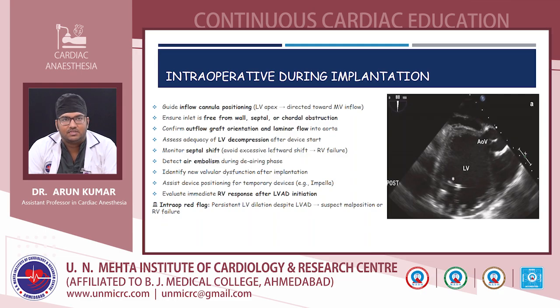And also we should monitor the septal shift, and there should not be any excessive leftward shift, which indicates RV failure. And also it is important to detect any air embolism during de-airing phases, and to identify any new valvular dysfunction after implantation. And also, we would like to assess the positioning of our temporary devices like Impella, and to evaluate immediate RV response after LVAD initiation. So for persistent LV dilatation despite LVAD, we should suspect any device malposition or RV failure.